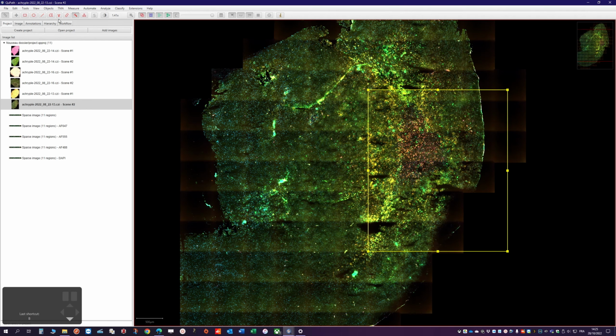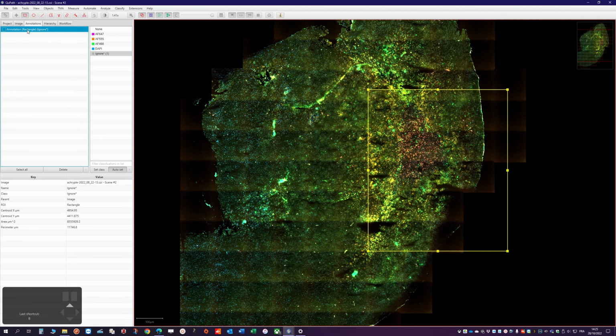If I click on the brush tool, does it work? Why is it locked? Interesting. Did I do something wrong? Normally I should be able... Oh, it's probably because it's protected. See, I told you, AutoSet is a very dangerous tool.